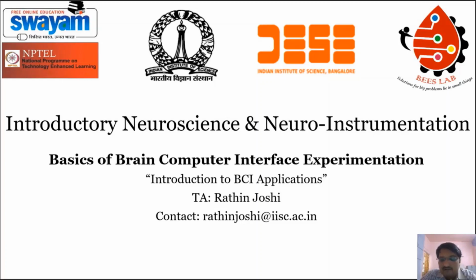Now mostly we are going to record EEG for this course. We are going to discuss how EEG can be recorded and how it is processed. EEG is very low in magnitude, in the microvolt range, some tens of microvolts. So how you are going to exactly get these small amplitude voltages, this kind of biopotential, will be covered in the third module.